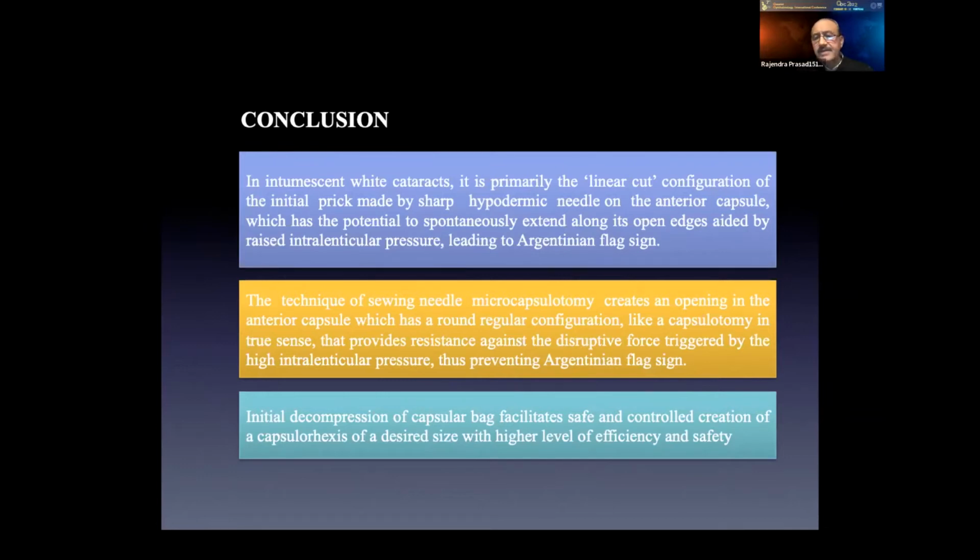And this device is definitely very safe and very simple. It's one of the simplest devices we can use to prevent the Argentinian flag sign in these intumescent white cataracts. So thank you very much.